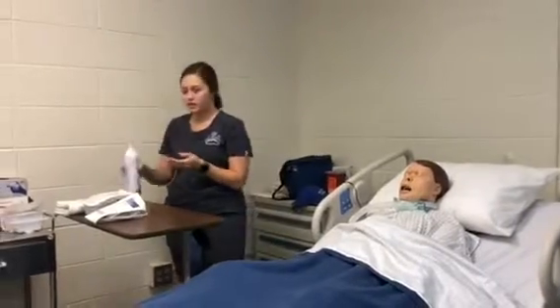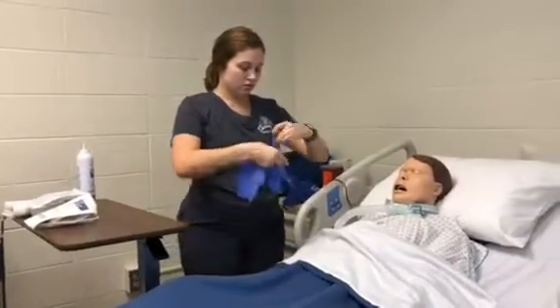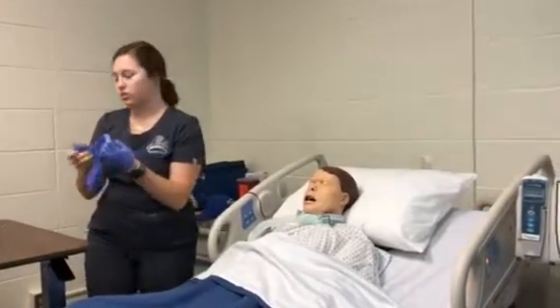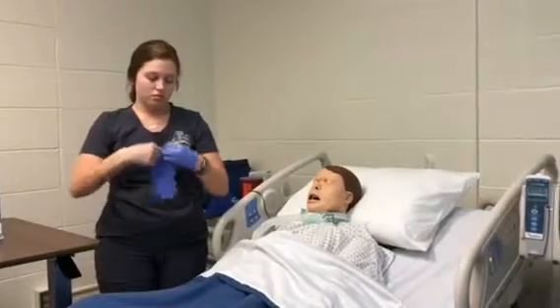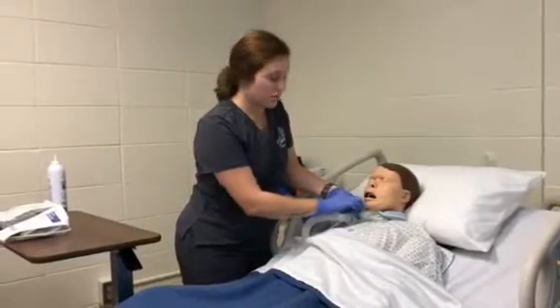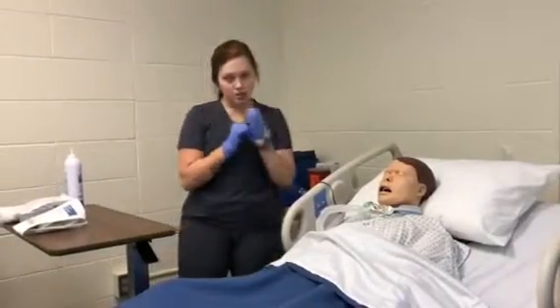I'm going to wash my hands, and I'm going to put on some non-sterile gloves, and I'm just going to remove the gauze. Yes, and we are in his private room, and the door is closed. So I'm just going to remove this dressing, and this is dirty and can just be thrown away, as well as our gloves.